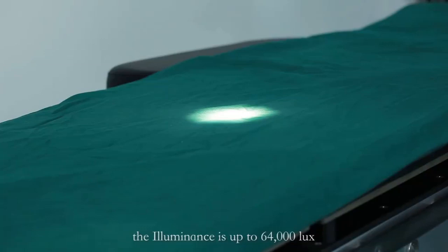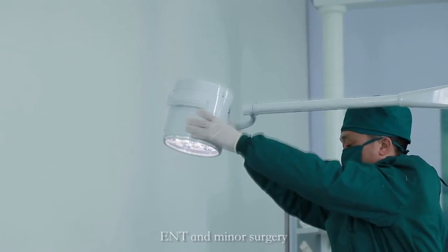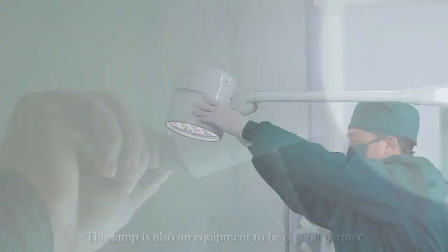The illuminance is up to 64,000 lux. It's the best choice for inspection, gynecology, ENT, and minor surgery. This lamp is also a great partner when having deep cavity surgery.